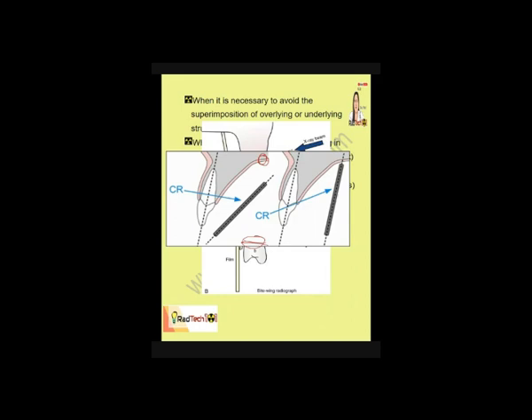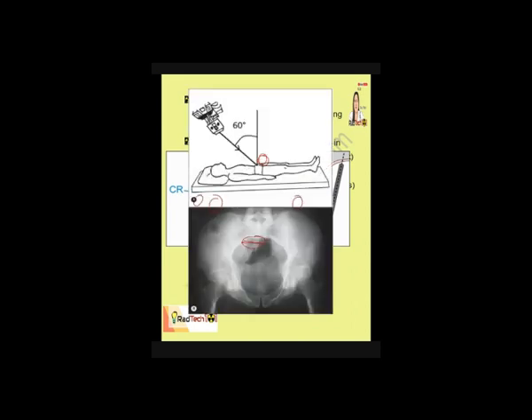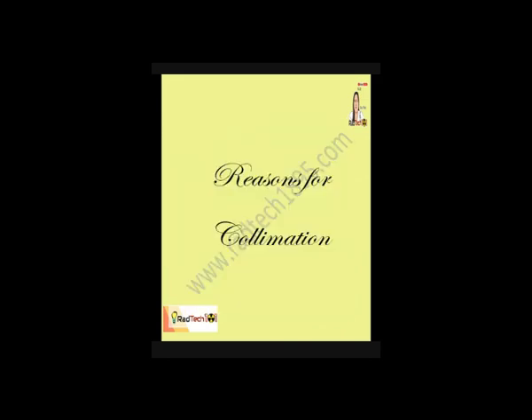So, ito din. So, we angulate. This is also a tooth. So, kapag diretso, hindi natin makita ang joints or ang conjunction. Pero kapag naka-angulate, mas ma-visualize yung part dito. The same here, we angulate para mas makita yung mga structures dito sa hip. Ito yung laman niya, para mas ma-visualize.